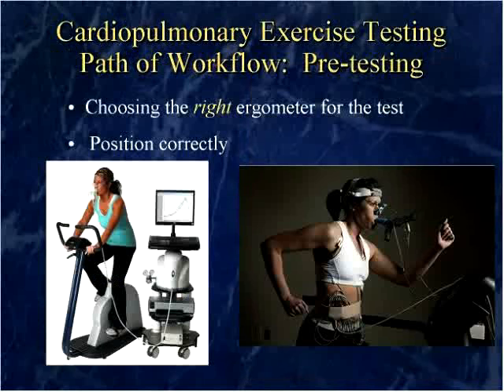But once you choose that ergometer, making sure that you position the patient correctly on the ergometer is important. If you're using a cycle ergometer, you should seat the subject on that particular ergometer and make sure that they have only about a 10% break in their knee with their foot horizontal to the ground, and that should be the appropriate location for the saddle height. It's very common that subjects or patients will say, oh gosh, you have this seat very high, because it's very common for novices to have the seat actually too low. But you want to make sure that that quadricep has an opportunity to stretch out with each stroke of the pedal, and that way the muscle itself won't tighten up as quickly. So you want to make sure that you adjust that correctly.